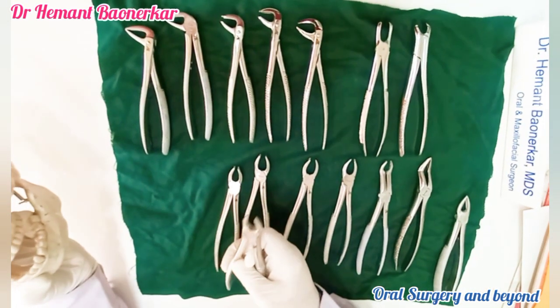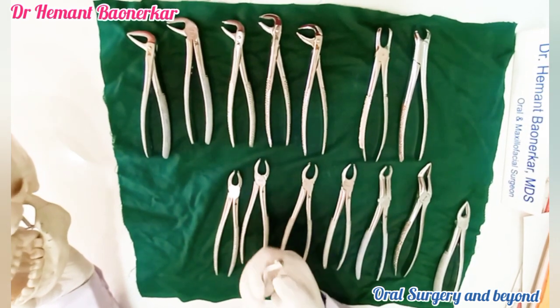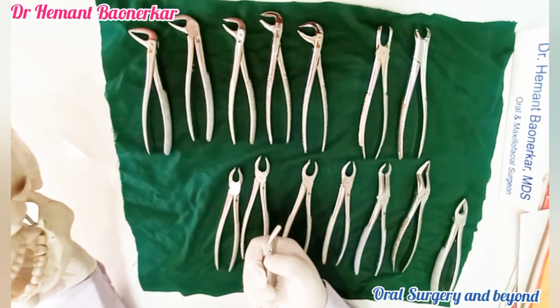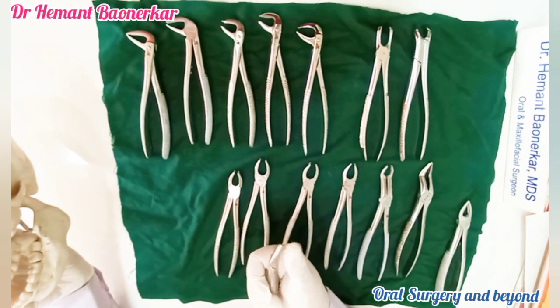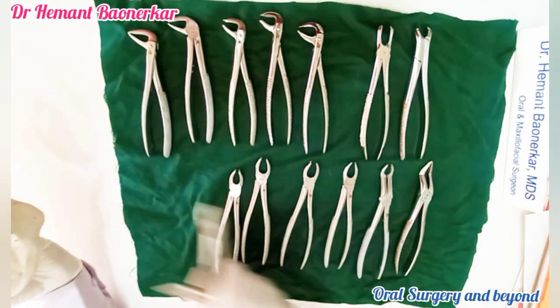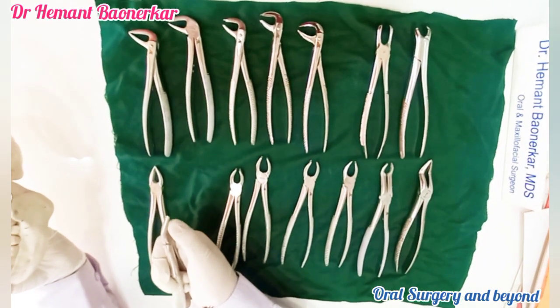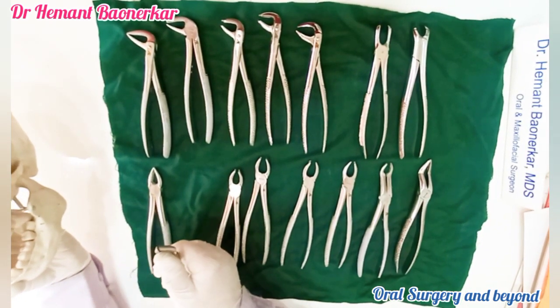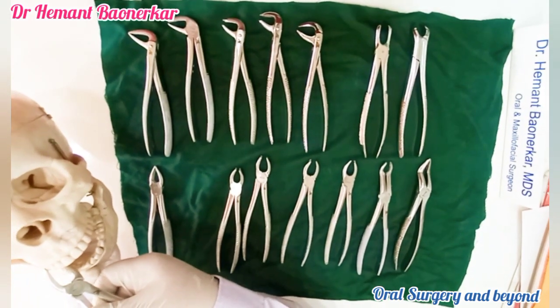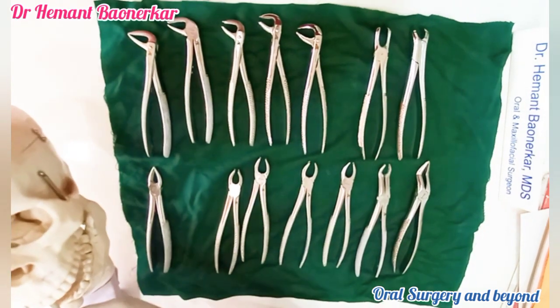The second one is the premolar forceps. There is always a slant in the maxillary extraction forceps, and the premolar forceps has an angulation and some kind of space between the beaks. What is the basic difference between maxillary anterior and premolar forceps? There is an angulation and space between. We can hold this premolar forceps like this and extract the premolar.